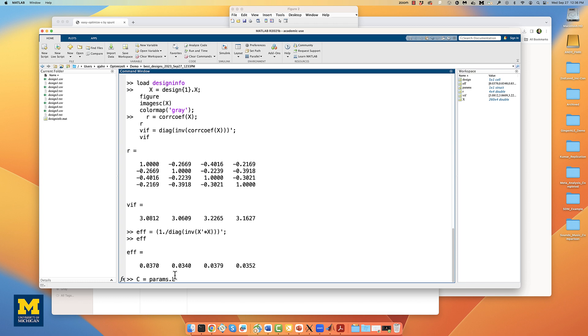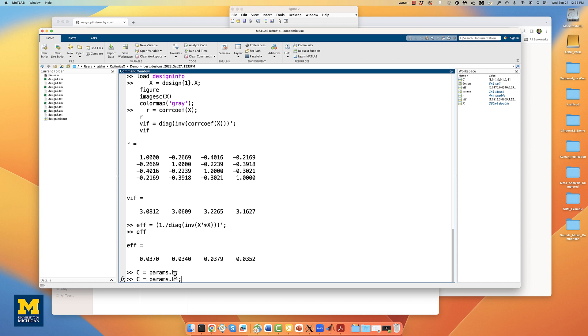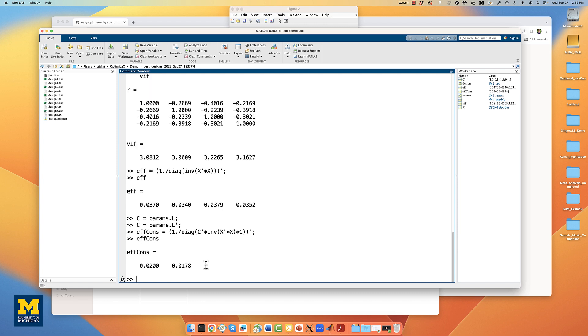When you ran the optimizeX script previously, you gave it the contrasts that you wanted to optimize, which are now saved in the variable params.l. We can then use those in a new formula and calculate the efficiency of each contrast and store it in a variable called EFFCONS. Notice here, we're using the same code as above and adapting it to only look at the efficiency for each contrast of which we have two in this design. Note that the first contrast has higher efficiency than the second one, reflecting the greater weight that we gave it in the optimizeX graphical user interface.